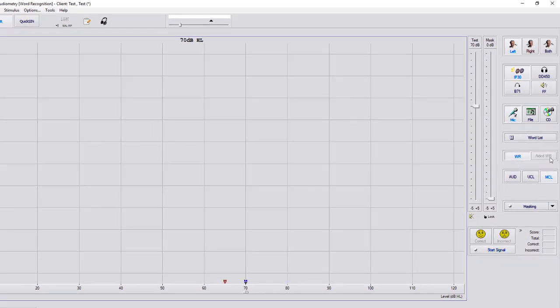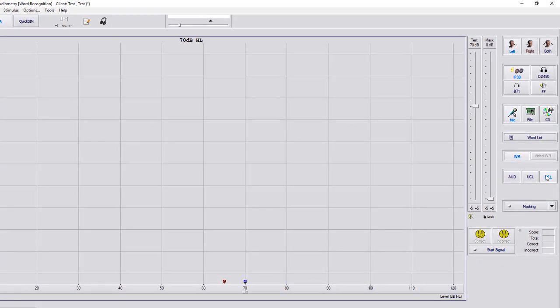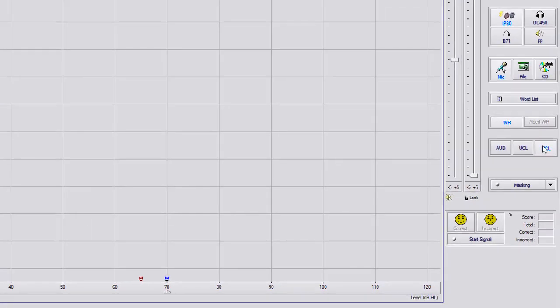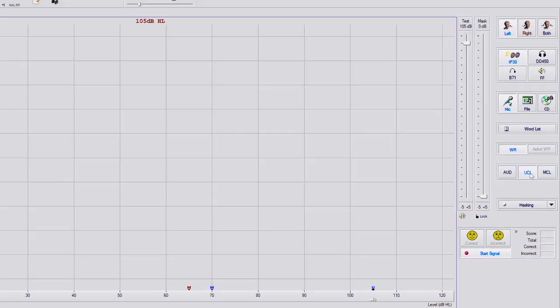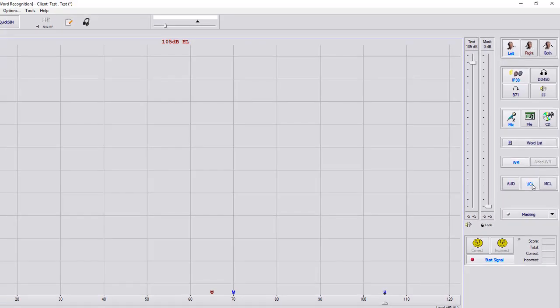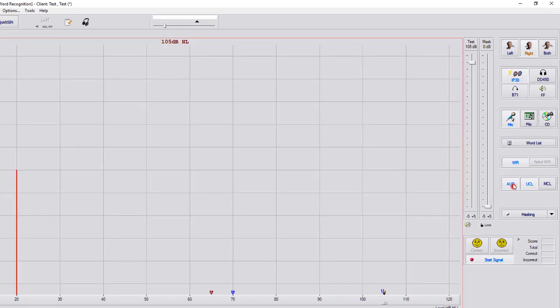This is going to give you a dB level. So you can also do this with the UCL as well. Get a UCL uncomfortable level, start signal, there's your U at the bottom, you can go right ear and get your UCL that way.